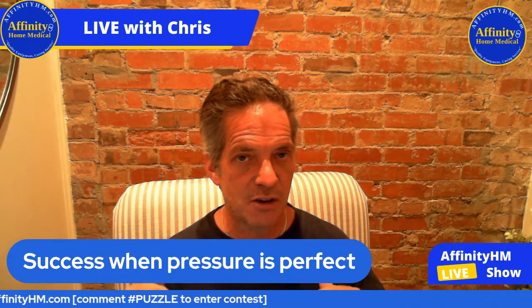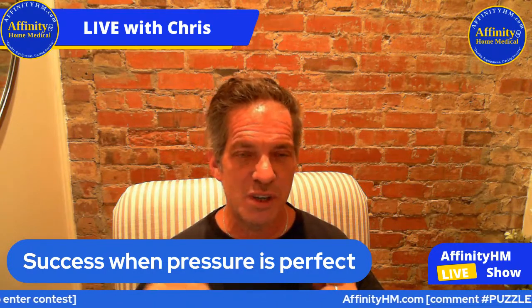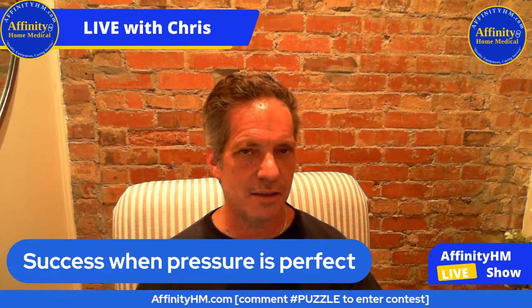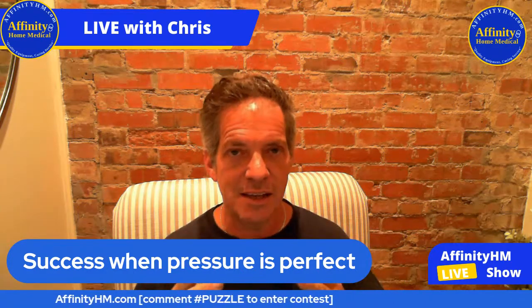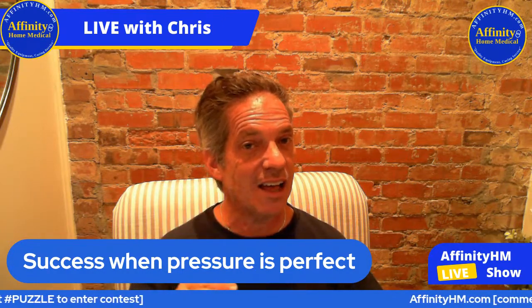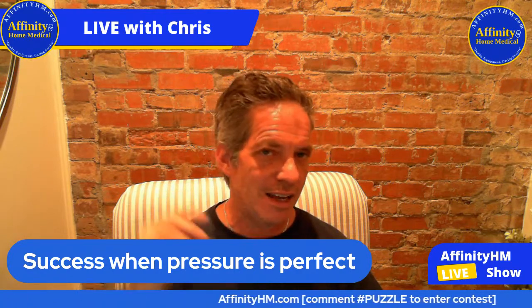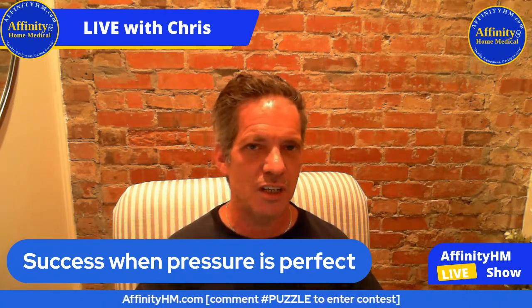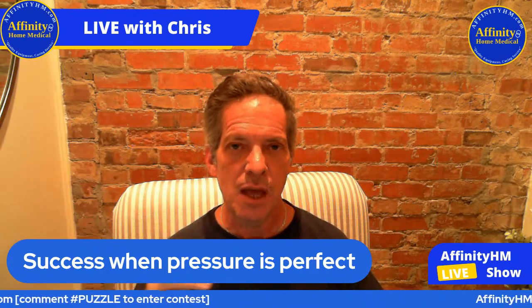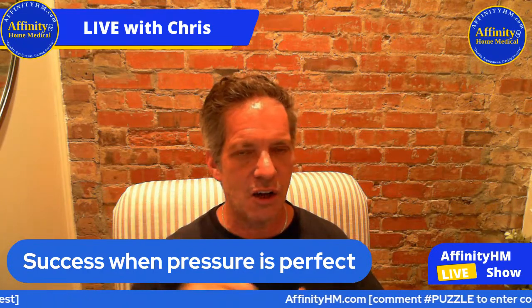If the doctor feels your best pressure is somewhere between 6 and 12, we set it at 6 and 12. The machine will run at 6 until it detects an apnea or a hypopnea. Once it does, it instantly changes to 6.2, 6.4, or it may be set to go 6.5, 7, 7.5, but it will stay within that 6 to 12, or wherever it's set, all night long.